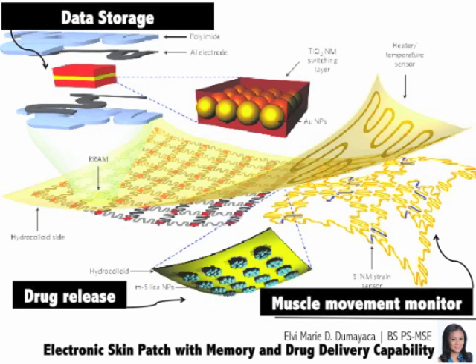The memory is built as a 10 by 10 array of storage locations, each at the intersection of meandering aluminum conductors. At each location is non-volatile metal insulator metal resistive RAM or RRAM. These 3 parts do not interact yet, nor is there processing, a battery, or wireless interface.